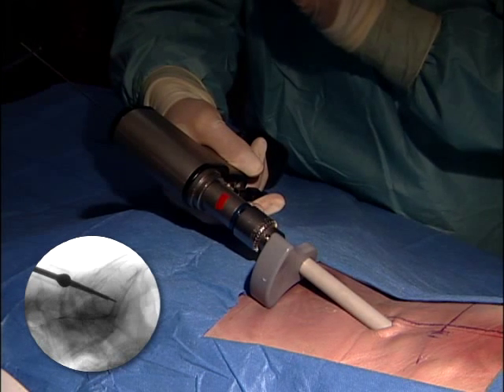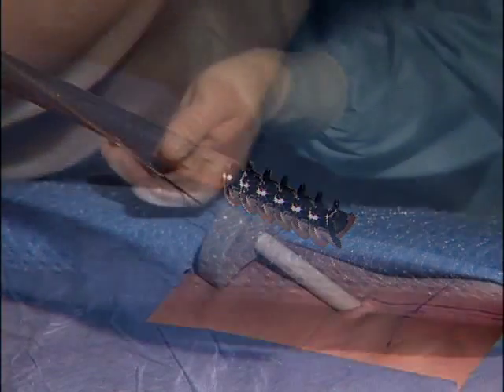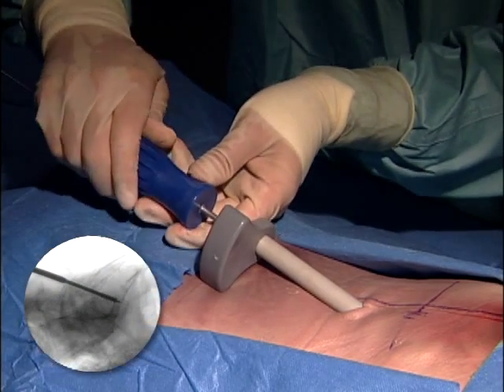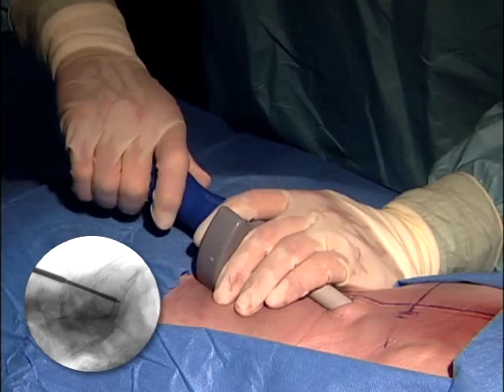The fluoroscopy image is saved and flipped to the second fluoroscopy screen. The tip of the drill is 30 mm from the sphere. This image can be used as a reference for gauging the depth of the tap and placement of the bone lock implant. The cannulated tap is advanced by hand into the bone until the tip reaches the appropriate depth, which is determined and verified by fluoroscopy. Once the appropriate depth is achieved, the tap is removed.